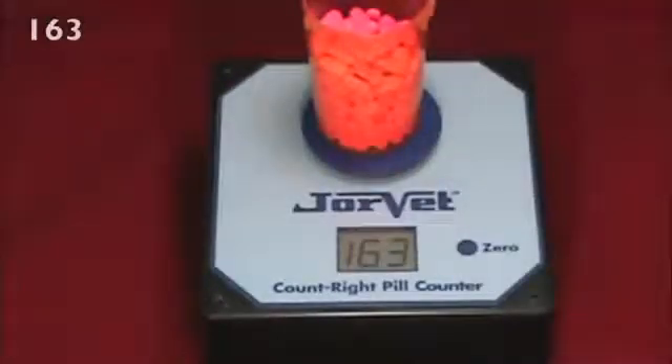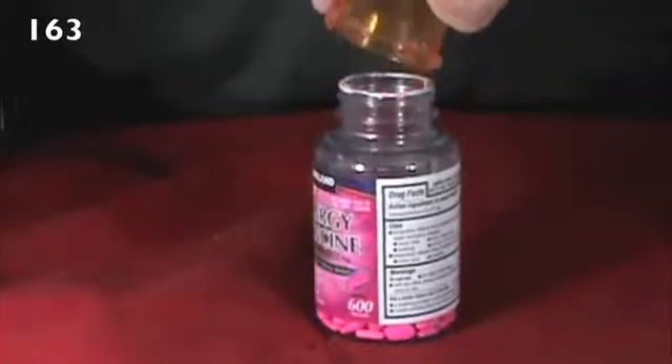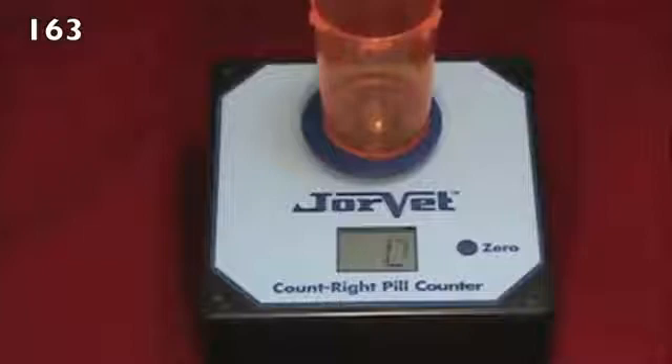Write the total down, then pour the pills into the original stock container. Now replace the same, now empty vial on the platform. This will automatically zero the counter.